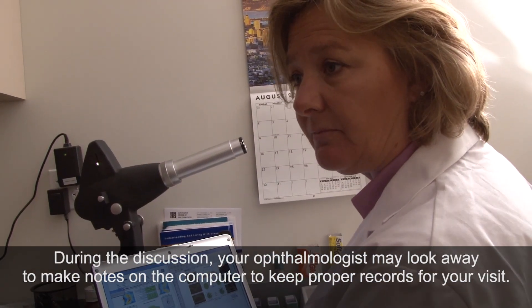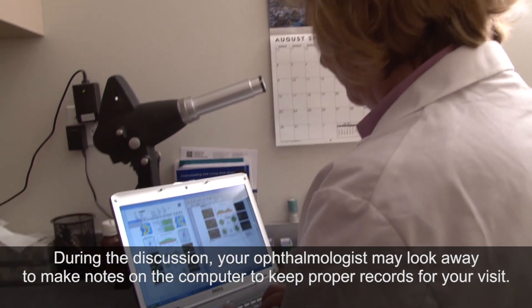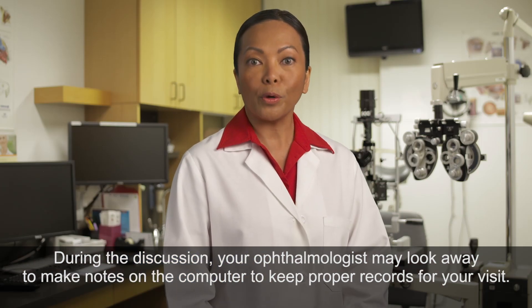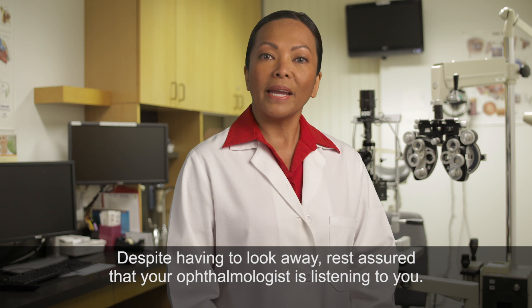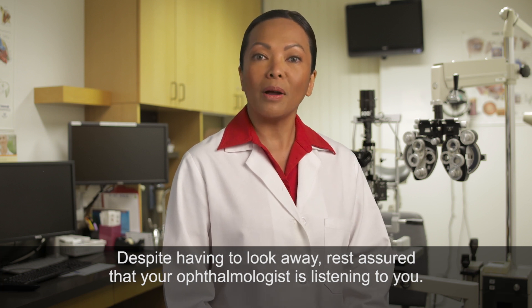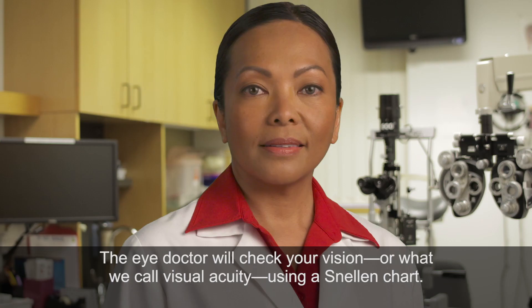During the discussion, your ophthalmologist may look away to make notes on the computer to keep proper records for your visit. Despite having to look away, rest assured that your ophthalmologist is listening to you.